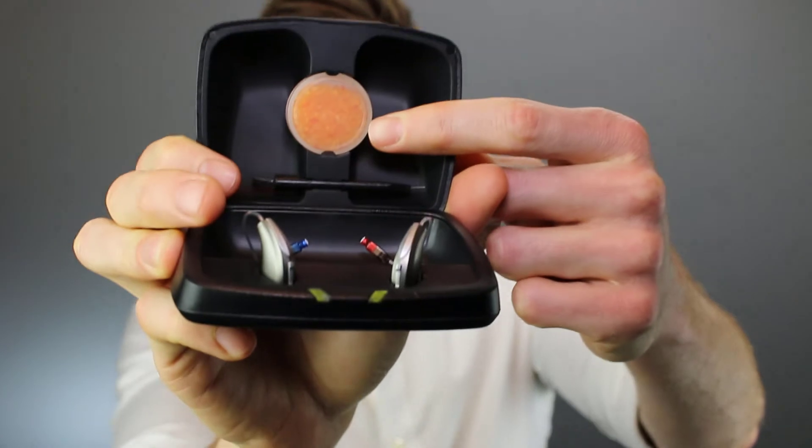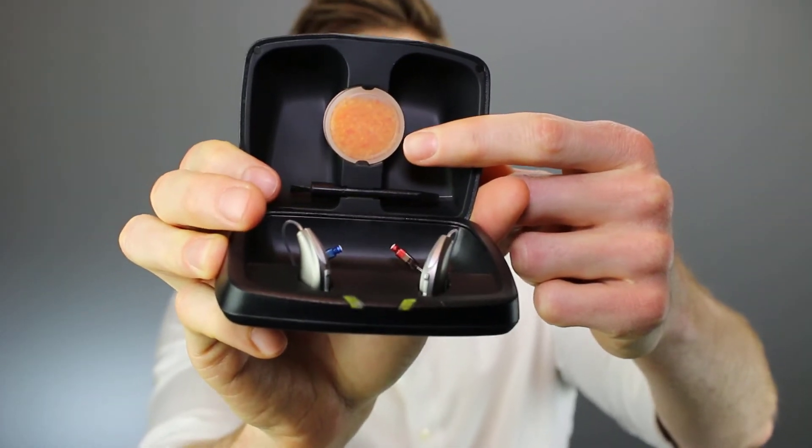Pro number two is the charger case. There are two distinct things about the charger case that I really like. First and foremost, it comes with a desiccant brick area. This is basically really important — when you put your hearing aids inside of the charger and you close the lid, you want to be able to remove the moisture from the hearing aids. On previous generations of rechargeable technology with Starkey, they didn't have a way to actually use a desiccant with their rechargeable devices. Now they have it, and I love it.